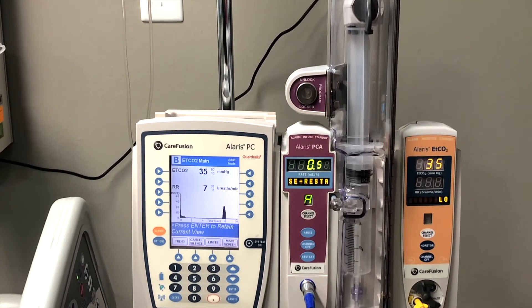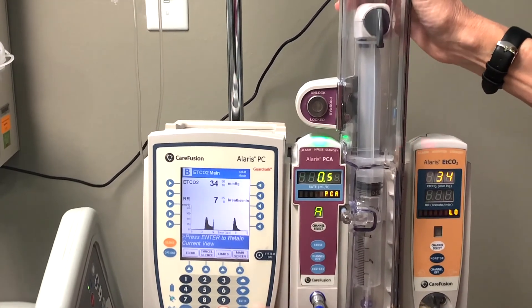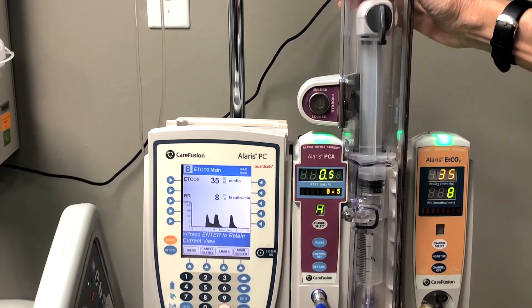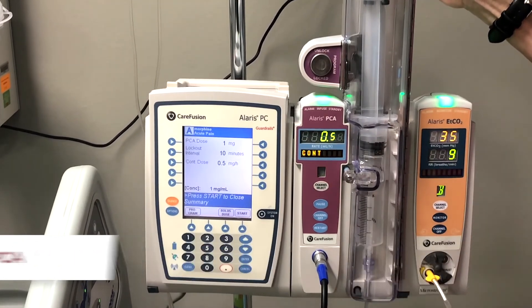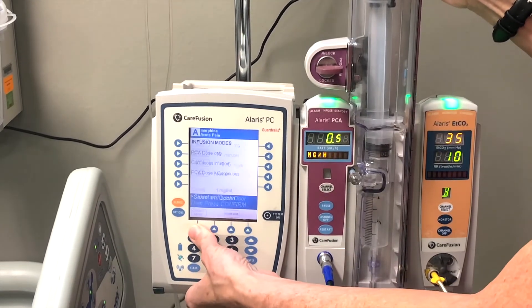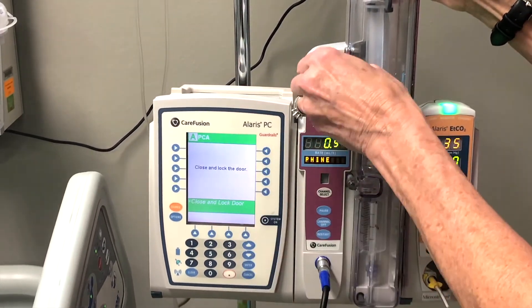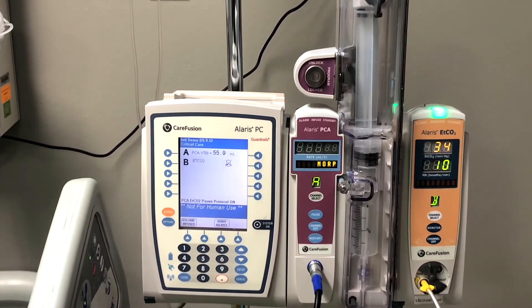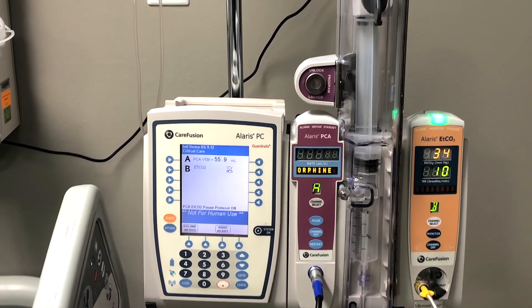We're going to encourage them to take deep breaths because we want to get that respiratory rate back up. The phone call to the physician has warranted a change in the order for me to come in and change to a dose-only PCA — no more continuous. So I'll do that by channel-selecting the PCA, pressing the program button, turning my key to the program position, and changing the mode of delivery to dose-only of one every 10 minutes. Then I'll press confirm, close and lock that door, press start, and it looks like our patient is good — respiratory rate's up and the light is green. So we'll just continue to monitor the patient.